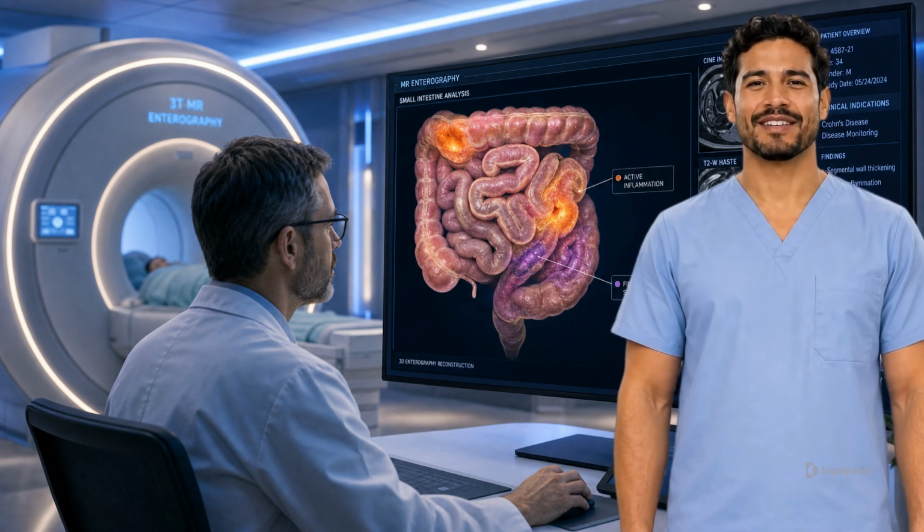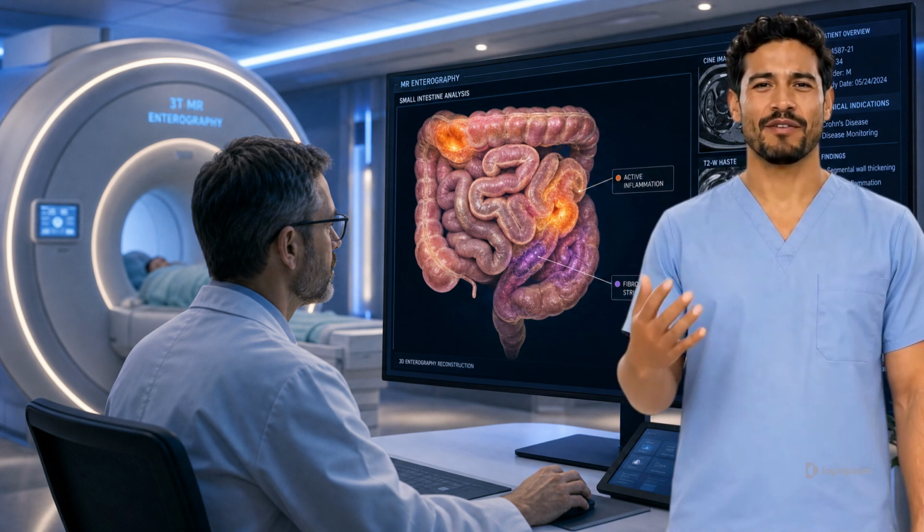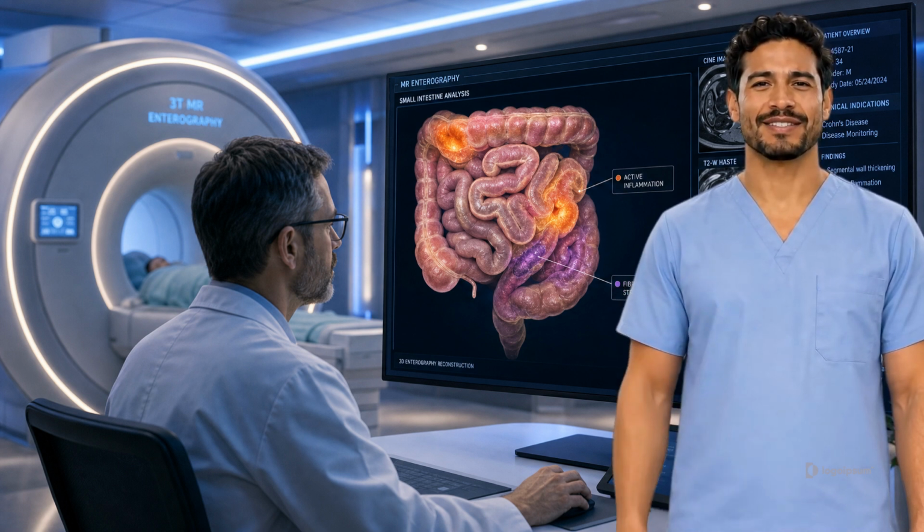By distinguishing active inflammation treated with anti-inflammatory medications from fixed fibrotic strictures or fistulas requiring surgery, MRE provides a safe, non-invasive roadmap that guides personalized care for patients with IBD.